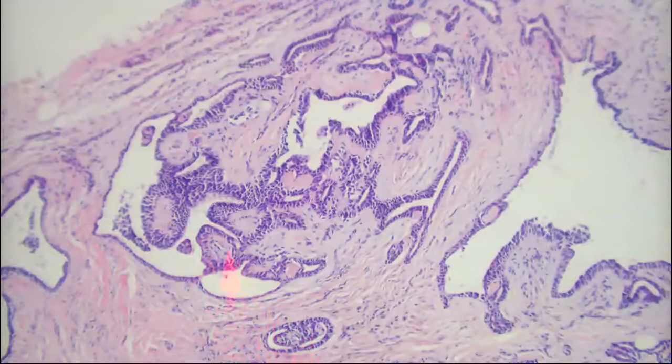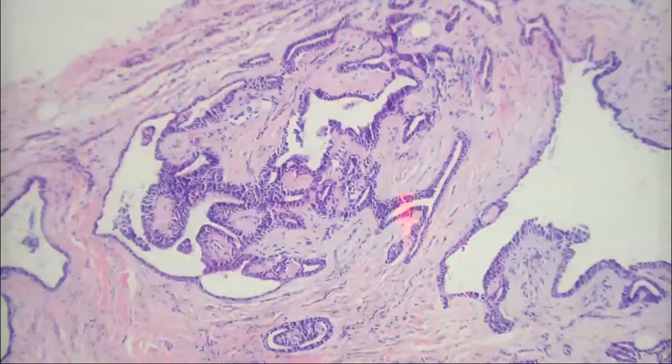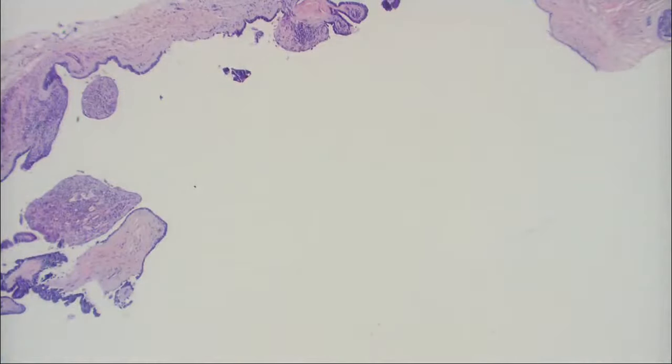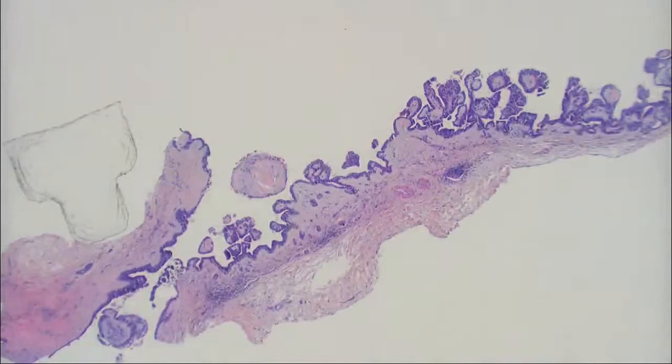Not really. Remember we talked about papillae earlier? So it's papillated over here. It's almost got kind of a quasi-cribriform morphology. It's got this little duct-like structure over here. So it's got a cyst that's got a little bit more solid area with papillated apocrine proliferation. So when you put it together, you've got a papillated apocrine cystadenoma. It's basically a type of apocrine cyst. It's not just an apocrine hydrocystoma because it's got this other component to it. Apocrine hydrocystoma is just a thin cyst with just pure apocrine lining, so it doesn't have all this kind of stuff to it.